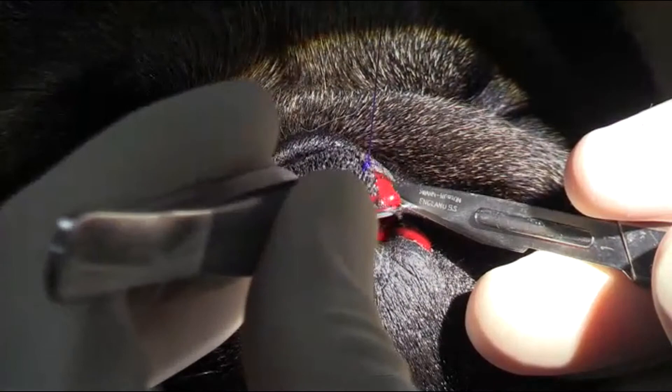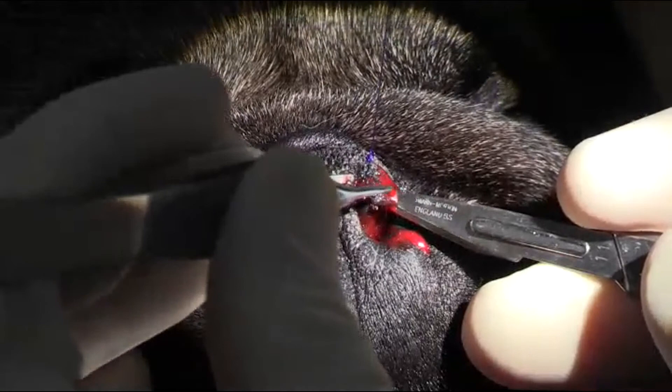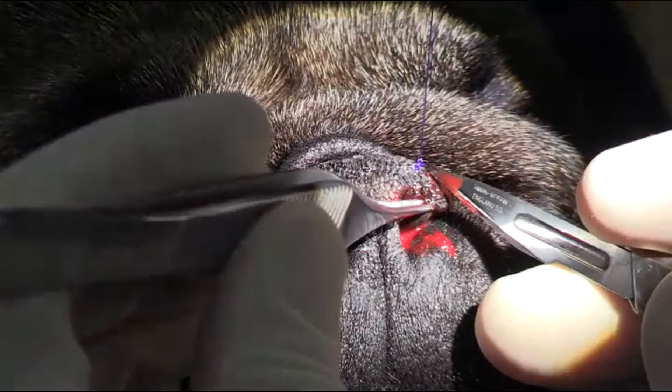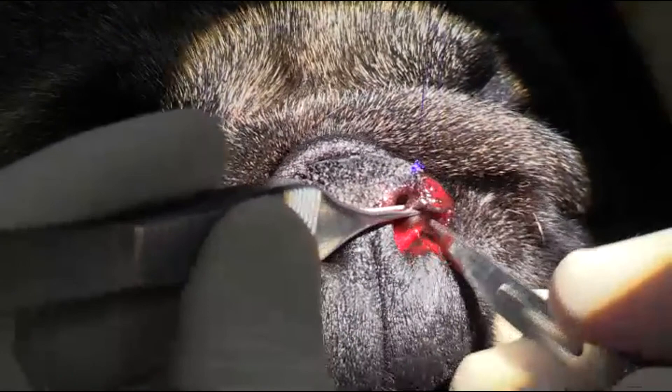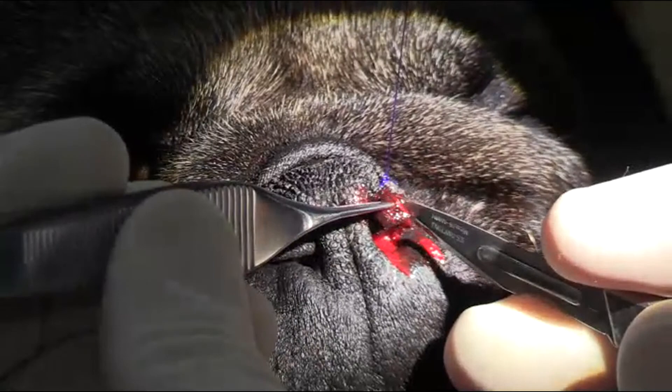I'm going in quite far deep into the nasal opening. When you do this properly the piece that you take out should look like a little diamond.